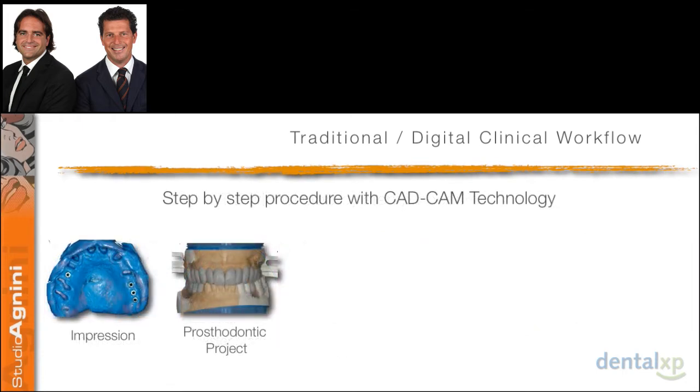In the last 10 years, CAD/CAM technology has already changed a lot the life of our dental technician. So this is not something that is going to be in the future, but this is already the present. Let's see, for example, this other complex case in which, even here, you can see teeth, implants, and periodontal abutments, and even here we start from the step of the final impression. After that, again, the prosthodontic project has been done.